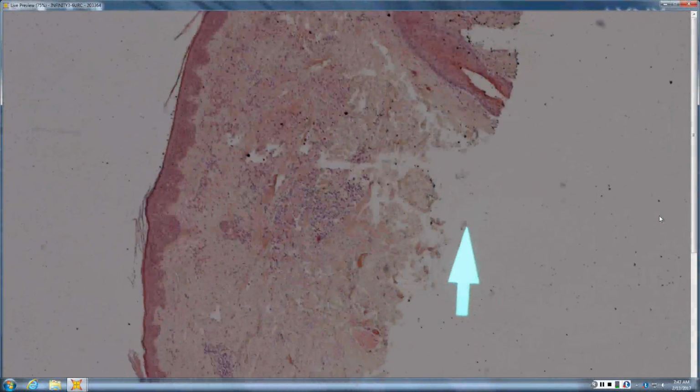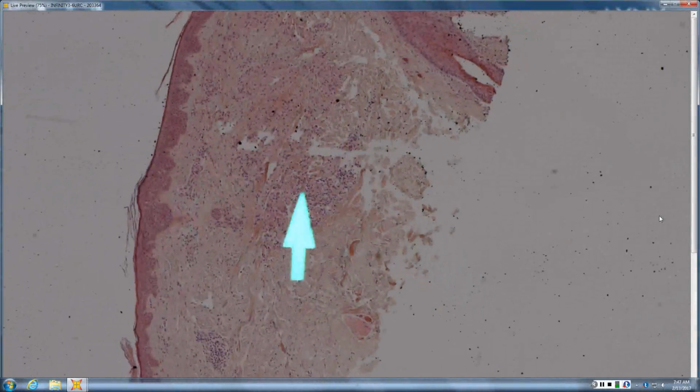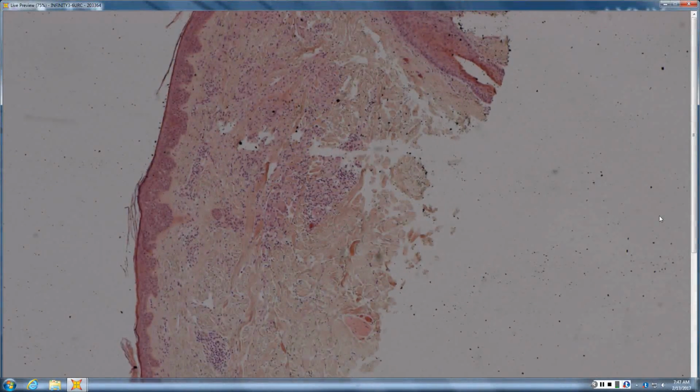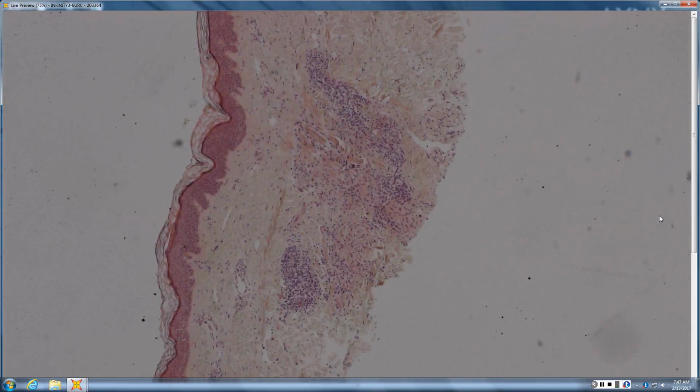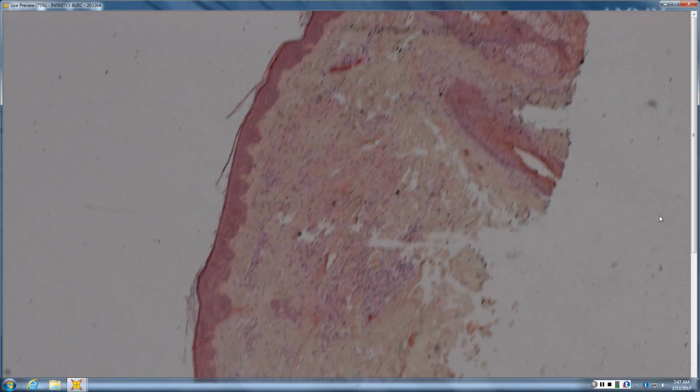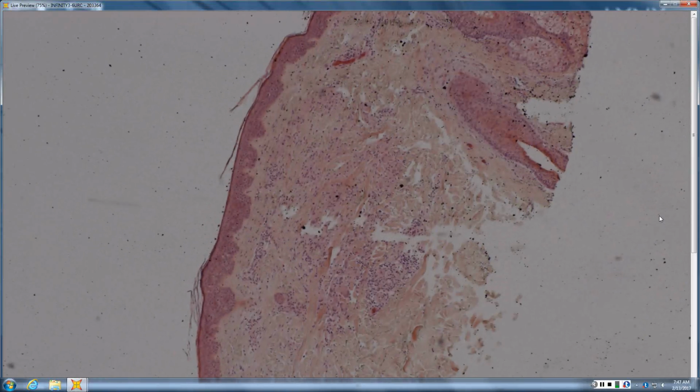Okay, so Shane, and the dermis. Is the process you're seeing top to bottom, side to side, or is it focal and patchy? Focal and patchy. Like histiocytic. Right. So lymphs and histiocytes, interstitial, focal and patchy, what would that usually be? So like GA, like granuloma annulare. Very good.